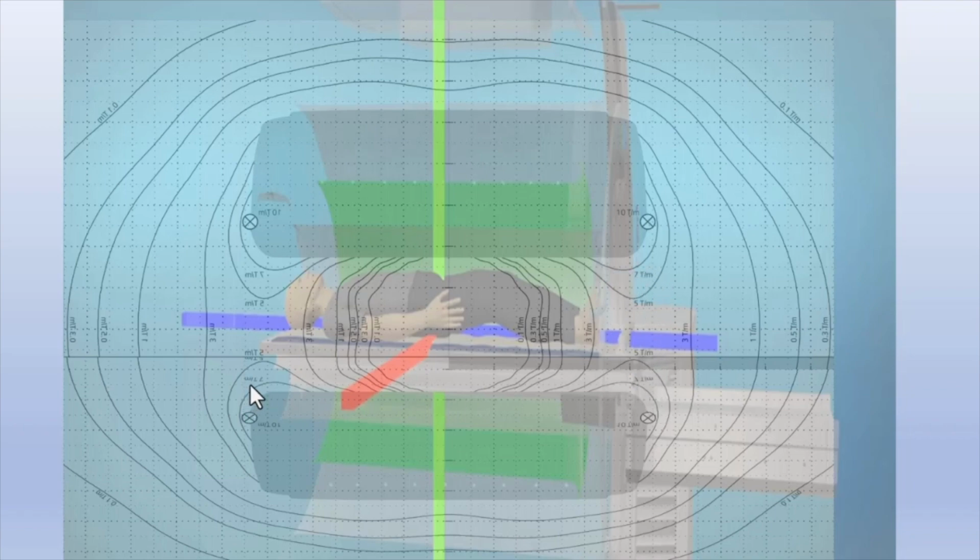So that's the thing that we're worried about when it comes to implants and what their maximum allowable spatial gradient values are that they're allowed to be put into contact with. At that point, you need to start to think about where the implant actually is inside the patient's body. Is it closer to the center? Is it closer to the periphery? If it's in the periphery, you will be exposing that implant to greater amounts of spatial gradient values.